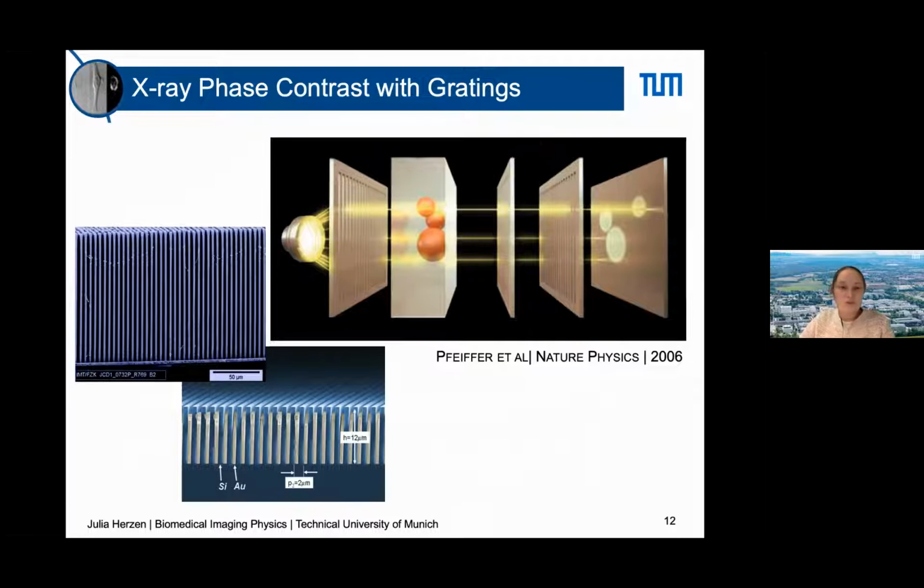With a standard source, due to exactly the person that we mentioned in the beginning, Franz Pfeiffer. He had an idea how to get these optics working with non-coherent sources, and the trick that he applied was to introduce an additional optical grating, which creates small coherent slits, or increases the coherence of one entire source spot, and it's just enough to illuminate the very important grating.